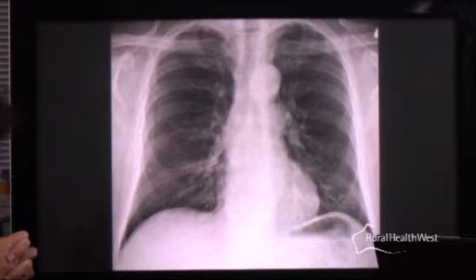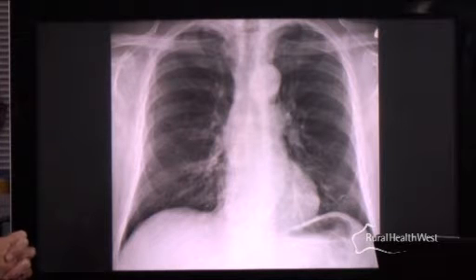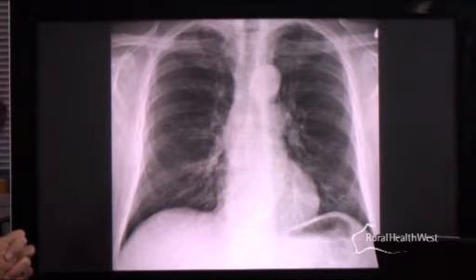And then I would move out to the lungs and have a look at the lungs and see if there's any nodules, consolidation, infiltrates or anything of that nature. And then move out to the pleura, see if there's any pneumothorax, effusions, pleural calcifications or any other pleurally related pathology. I then move out to the rib cage and go through all the ribs and see if there is any rib pathology or rib fractures. And then move out to the soft tissues and look at the chest wall, see if there's been a mastectomy or anything else going on in relationship to the chest wall.